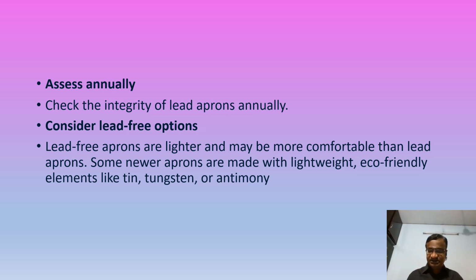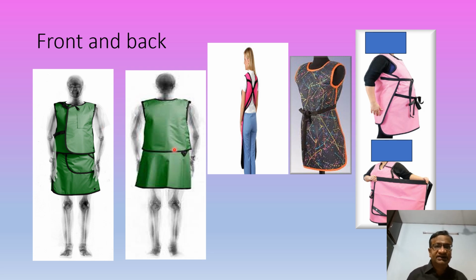I'm coming to the next one. Okay, this is what is called the back. This is not a back cover. Even pregnant persons can wear like this. This is very important if you go this way, that way and all.